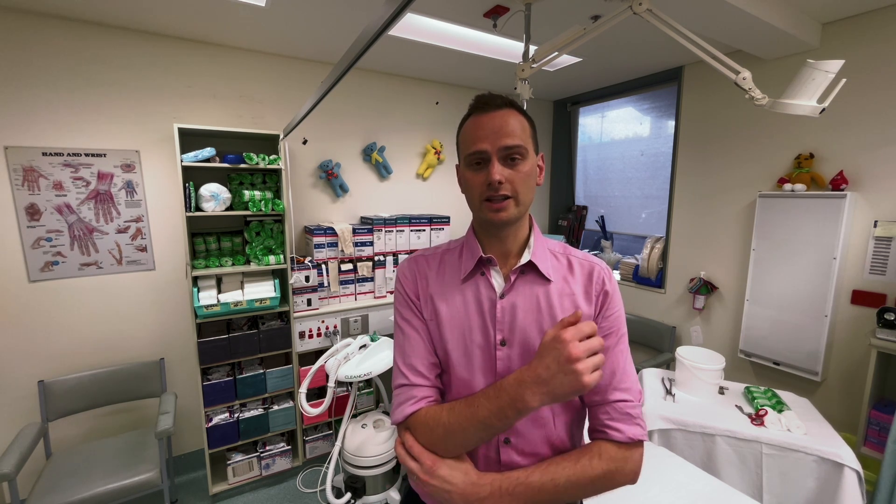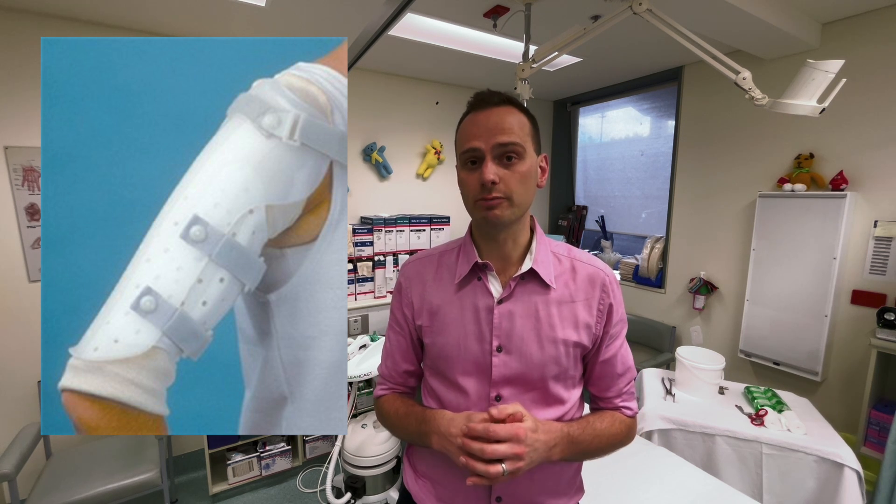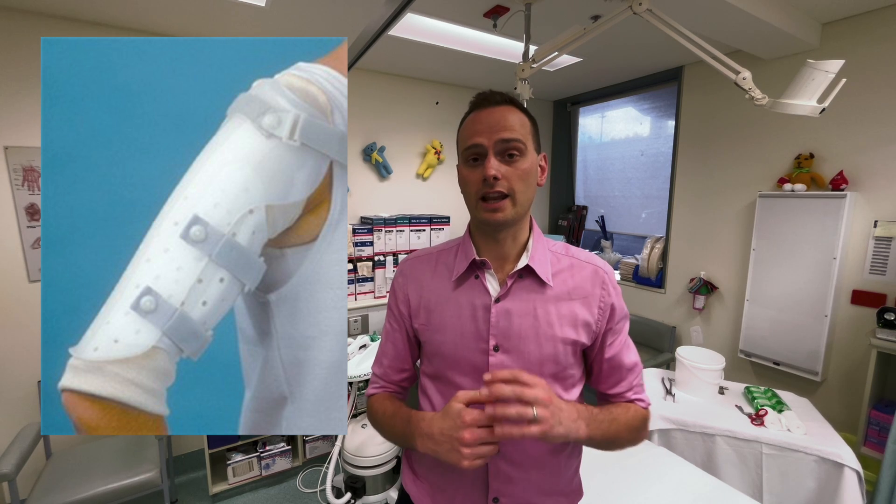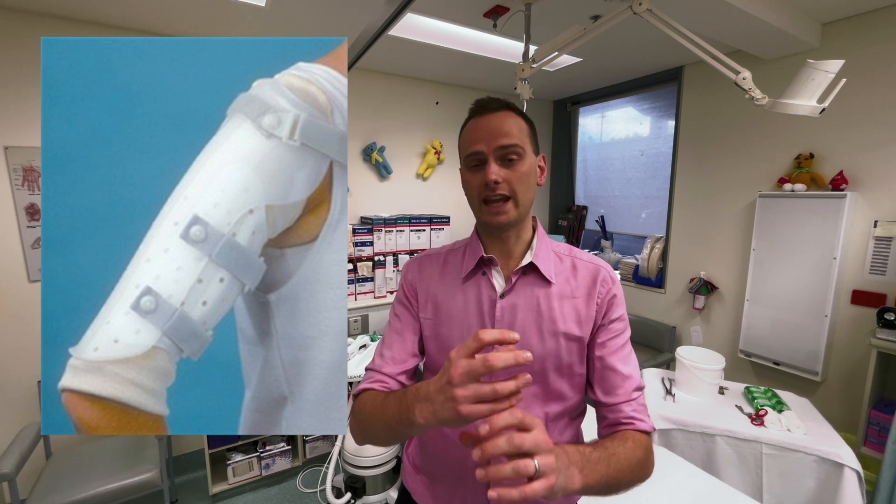The general principle is that it provides traction down as well as lateral support. We will typically convert a U-slab for a humeral shaft fracture to something called a Sarmiento brace or coaptation splint. This is a thermoplastic splint that encircles the humerus and allows compression to cause elongation, helping with reduction and immobilization. A Sarmiento brace is typically applied by trained allied health staff using specialized equipment.